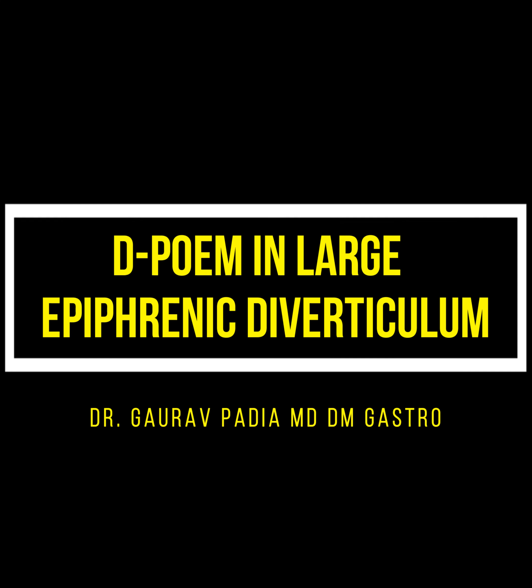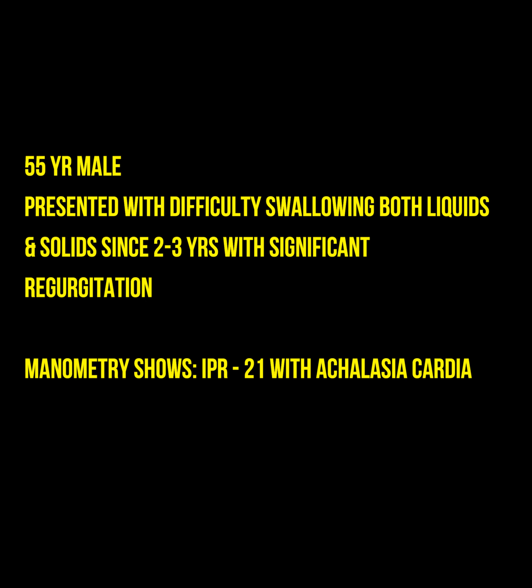This is a case of diverticular POEM in a patient with a large epiphrenic diverticulum. A 55-year-old male presented with difficulty swallowing both liquids and solids for the past 3 years, with significant regurgitation. Manometry shows the presence of achalasia cardia.